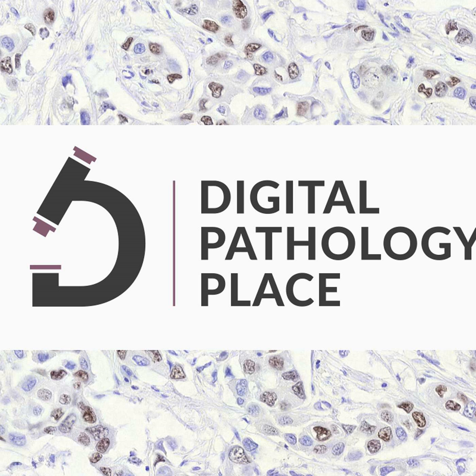Yeah, they present a clear and practical framework for the effective implementation of digital pathology in routine anatomic pathology practice, and they define digital pathology as digitization of microscope slides into high-resolution whole slide images. We know that definition, and digital systems are becoming increasingly integrated in pathology laboratories, but they mention here, hey, the physical archiving of microscope slides remains a legal and procedural requirement in many countries, particularly for histological and cytological materials.